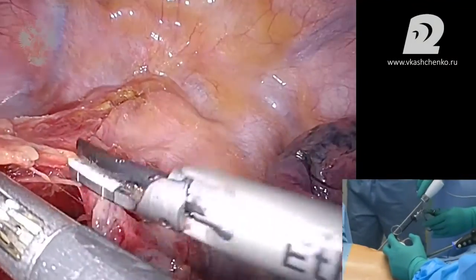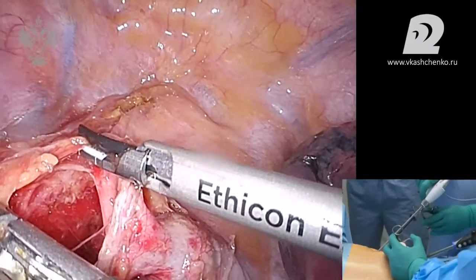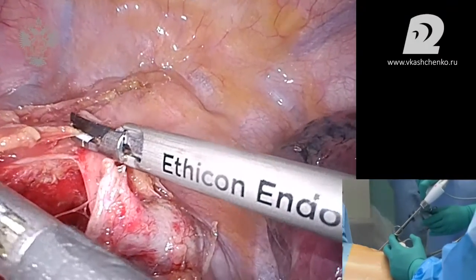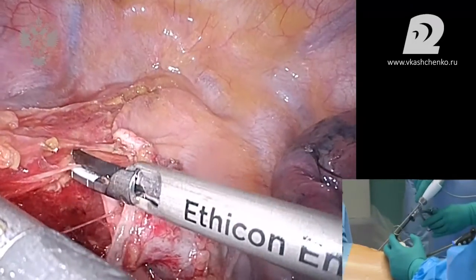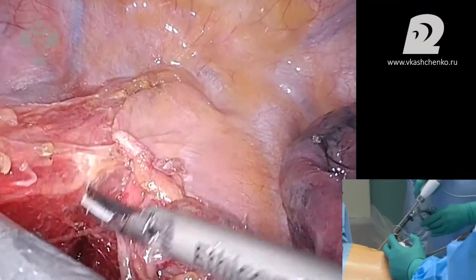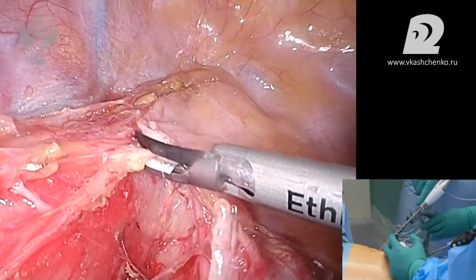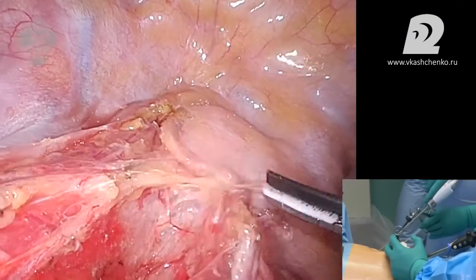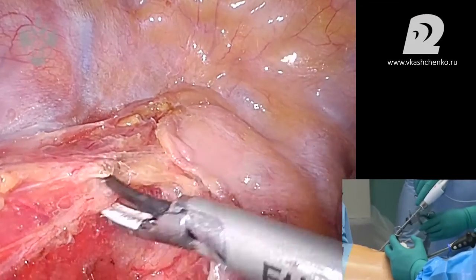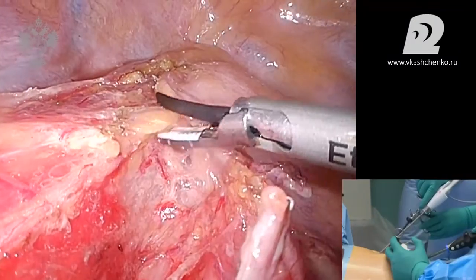We're going to start paratracheal dissection. I think it's a very interesting one, because thoracoscopic procedure allows us to manipulate in the zones which we usually can't reach that easily through conventional approach. This is the vagus nerve, and now we leave it a little bit laterally.